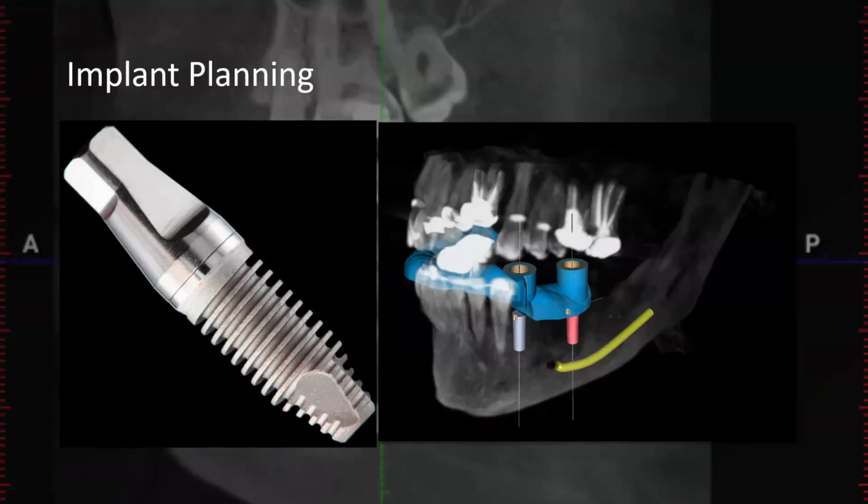Of course, you have to have the patient with a splint on, with a guide on. You have to have radiographic markers, and it will direct you right into that space. I think we don't trust robots to do it alone, so you still have the dentist's hands on it, but it's really cool. You have that tactile sensation, and it's limiting where you can go in relation to the patient. So a lot of neat technologies out there to accurately place and plan implants.